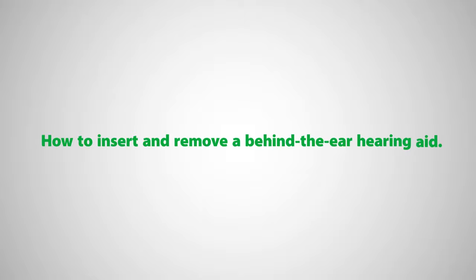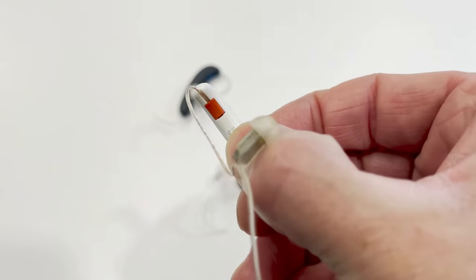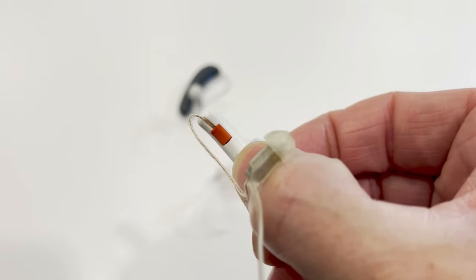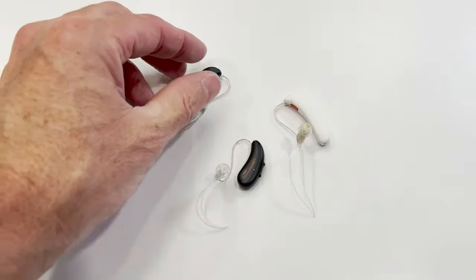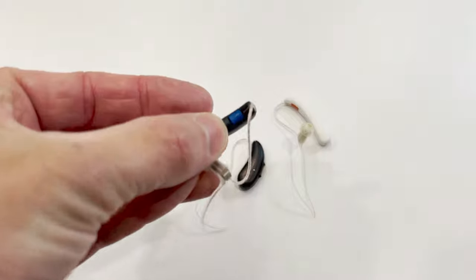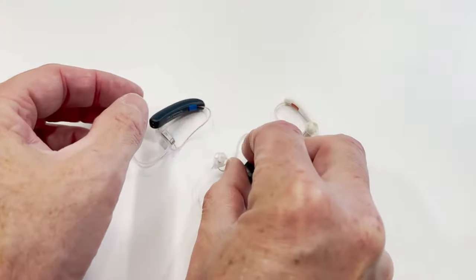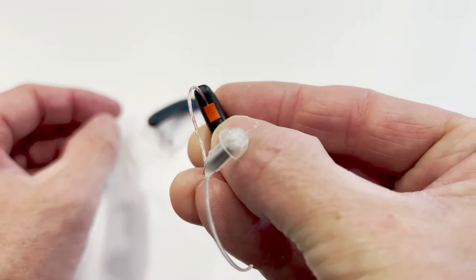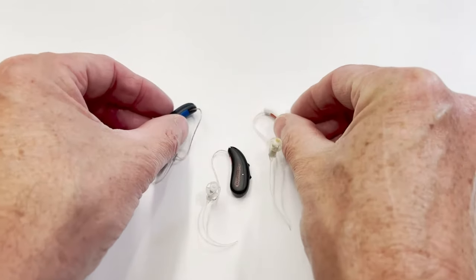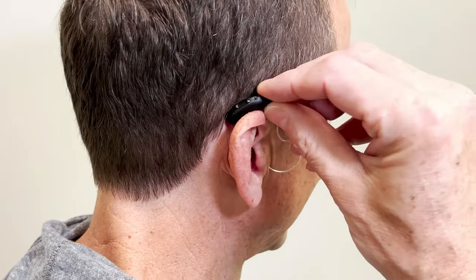Here's how to insert and remove a behind-the-ear hearing aid. You can tell the right hearing aid from the left by its color: the right hearing aid will have a red dot or red serial number on it, and the left hearing aid will be indicated by the color blue. Where the colored mark is can vary by model, but it will always be red for the right side and blue for the left side. An easy way to remember is that R stands for red and right.